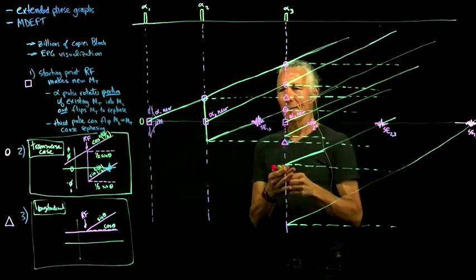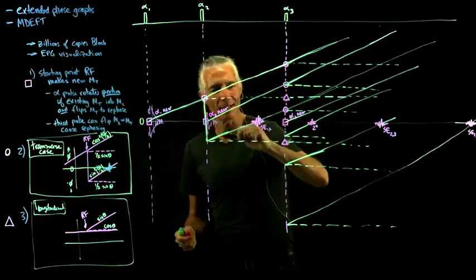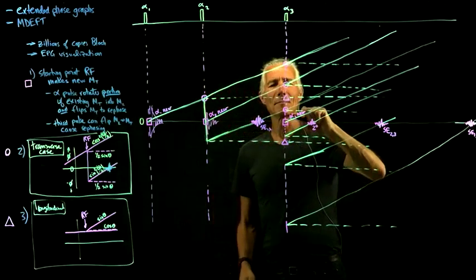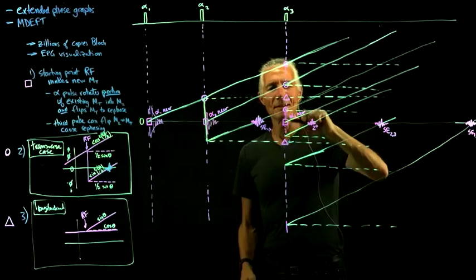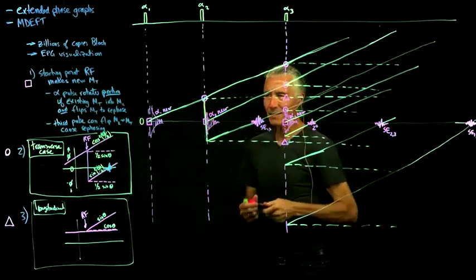And what did we forget? We forgot to put in the FIDs. So here's the, don't want to mess this guy up too much. Here's the FID from this guy. Okay, and then last but not least, we have the stimulated echo.